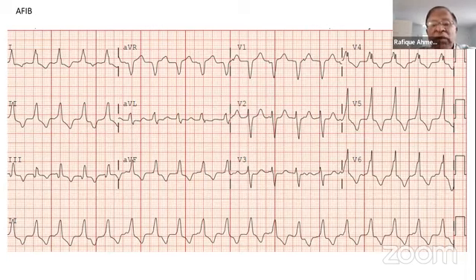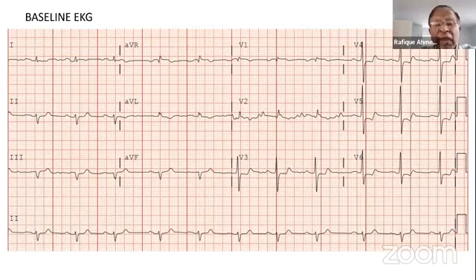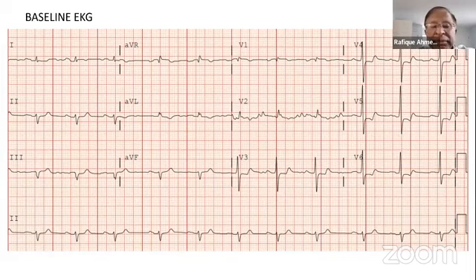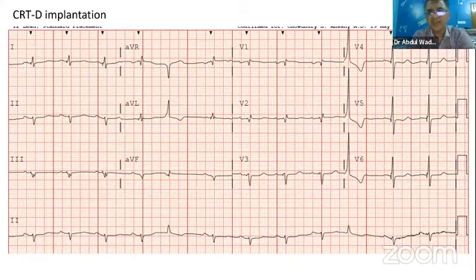But this is a very good ECG, Hafiz, because if I could draw a P wave before the QRS, it will be typical left bundle, right? It will be very difficult to debate that. Yeah, AV dissociation is actually the clue.